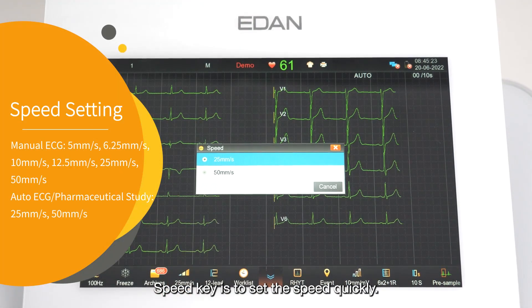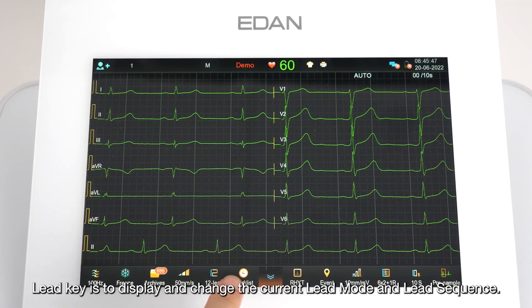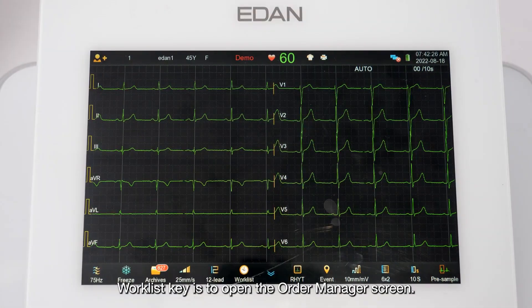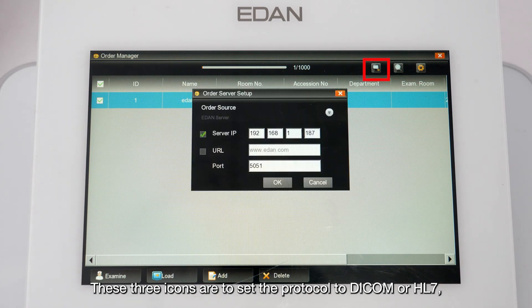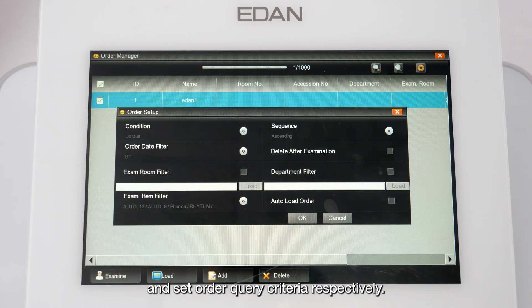The Speed key sets the speed quickly; this setting varies depending on the test mode. The Lead key displays and changes the current lead mode and lead sequence. The Worklist key opens the order manager screen. These three icons set the protocol to DICOM or HL7, search orders, and set order query criteria respectively.